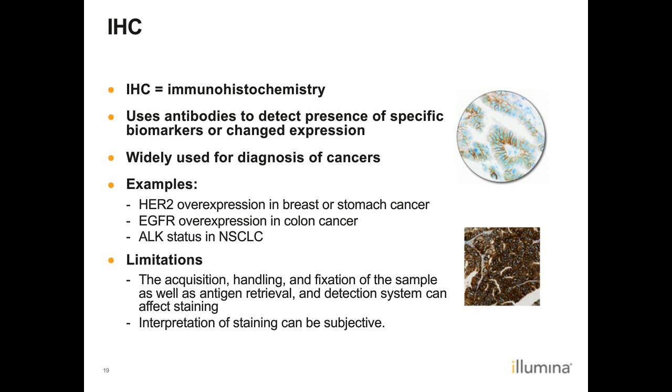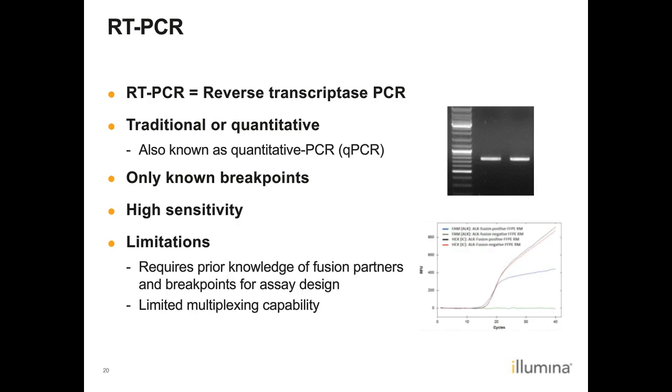Reverse transcriptase PCR, or RT-PCR, requires the knowledge of fusion partners and location of the breakpoint for assay design. Similarly to FISH, it has no discovery power, but due to high sensitivity, it can be used for monitoring of minimal residual disease following treatment. It is not a single gene test like FISH, but its multiplexing capability is limited. It can be performed as standard RT-PCR or quantitative PCR.